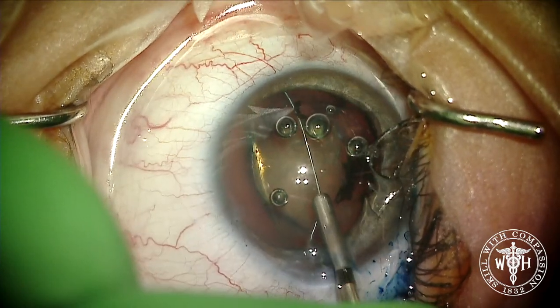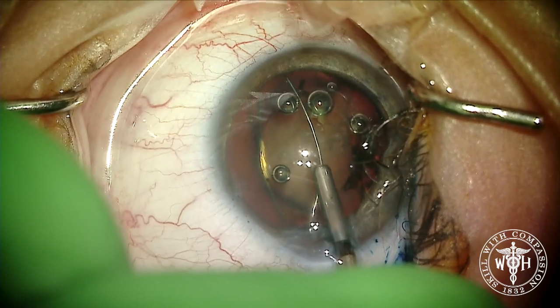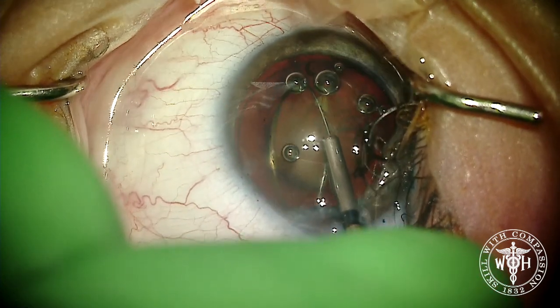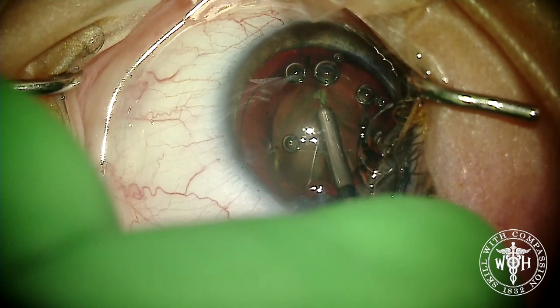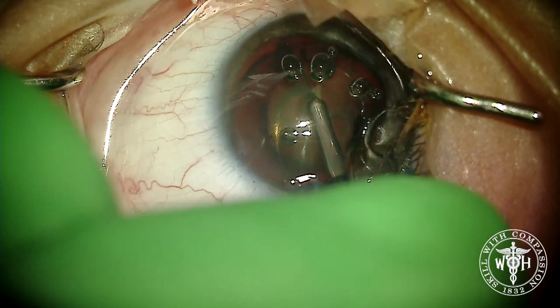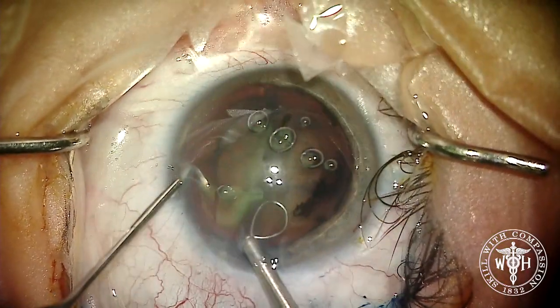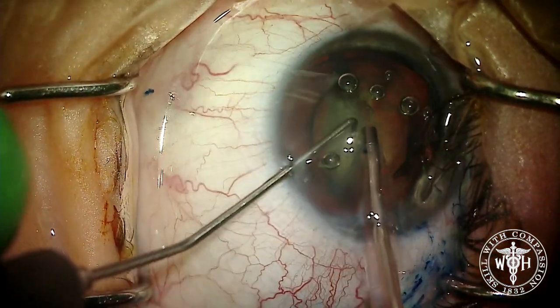This is not a fast maneuver — it's a carefully controlled maneuver. We'll begin to constrict the nitinol loop, which will essentially divide this lens in two without using any phacoemulsification at all. As I'm pulling the loop back, I'm also advancing the MyLoop device a little bit to help prevent rotation of the lens.